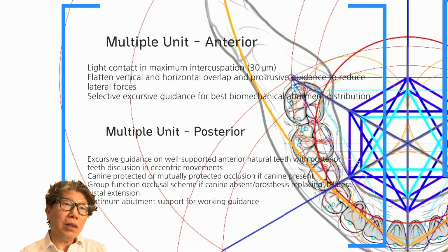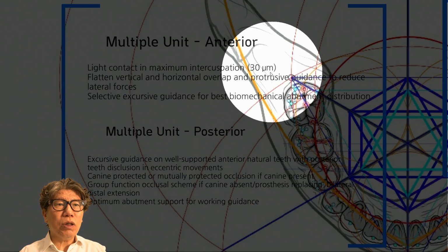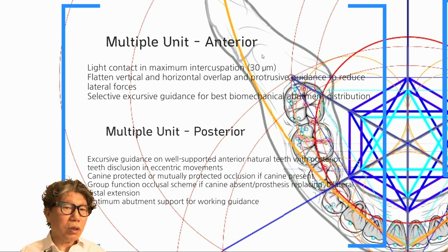anterior teeth. However, the 30 micrometer mentioned here is based on very healthy individuals. This refers to those with minimal molar sinking, and in reality, if the periodontal ligament has widened or the patient has periodontal disease to some extent, the movement can be 0.1 millimeter. In that case, you need to raise it by 0.1 millimeter. Otherwise, all the teeth will flare forward. The basic principle is to compensate for the sinking of the molars to lift the anterior teeth. Then, natural teeth and implants must also be lifted accordingly. It needs to be lifted, but there is something a bit complicated here.